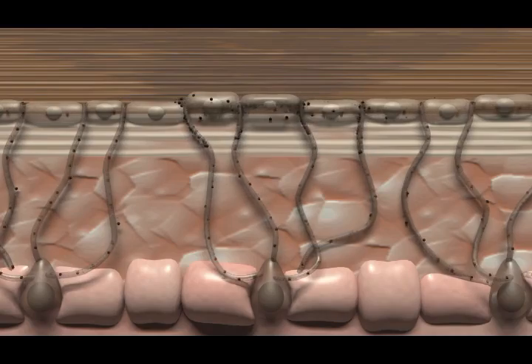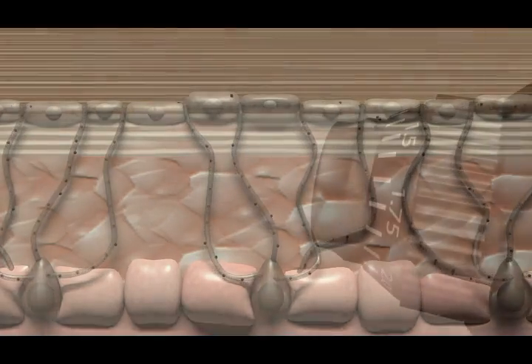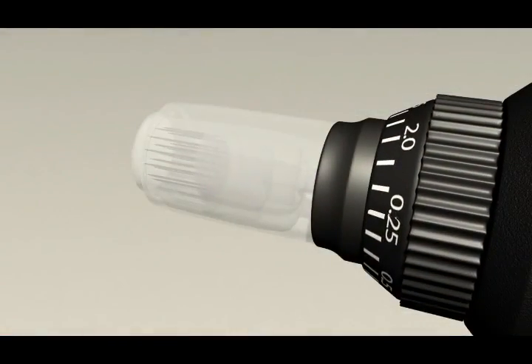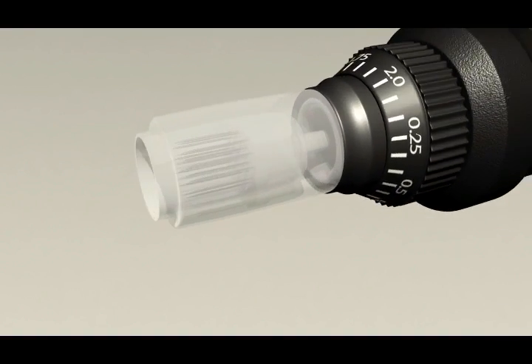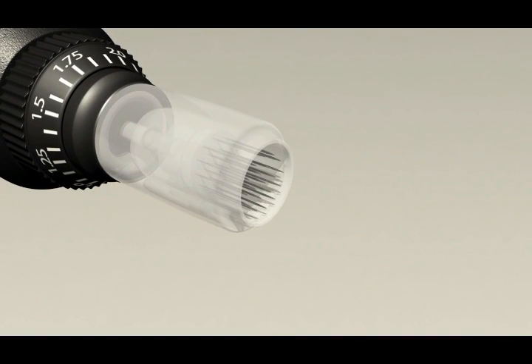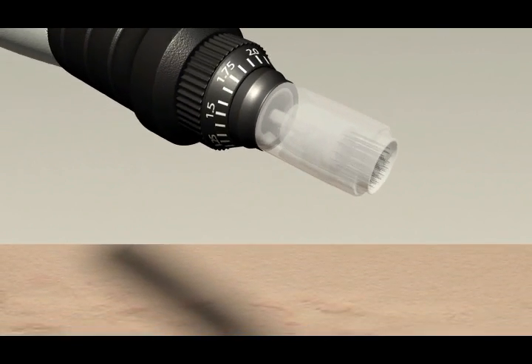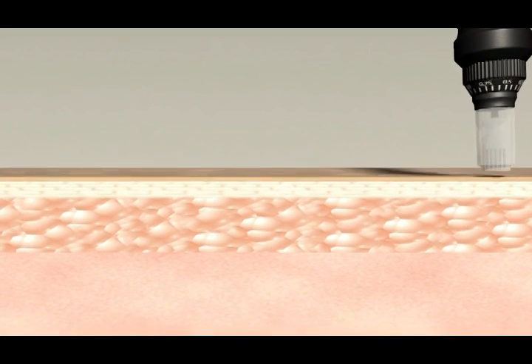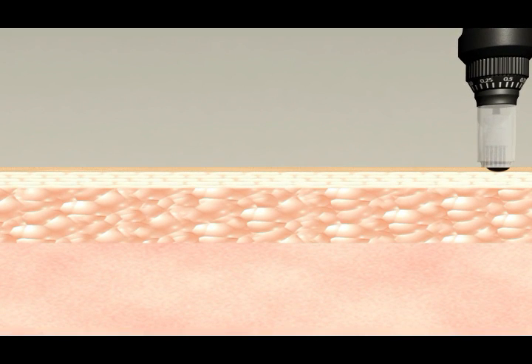Easy, precise, adjustable needle depth for laser-like precision and controlled depth of penetration. With precision depth adjustable needles for consistent results and patient comfort, ultrafine needles produce over 2,000 micro channels in the epidermis and dermis per second.